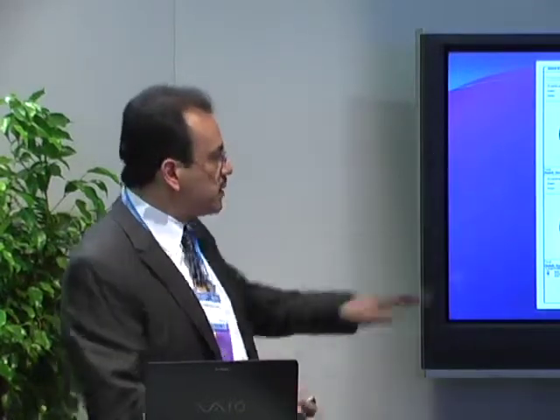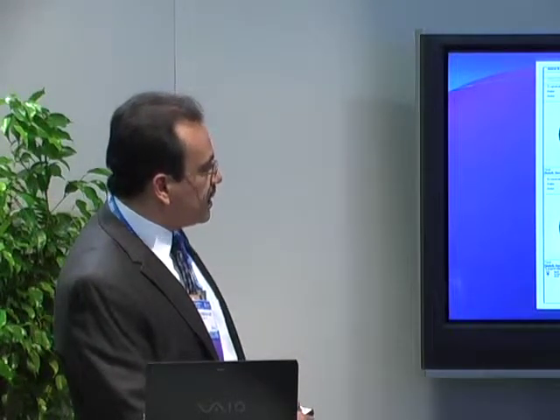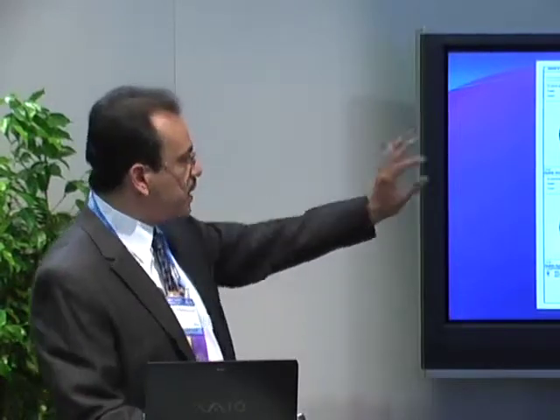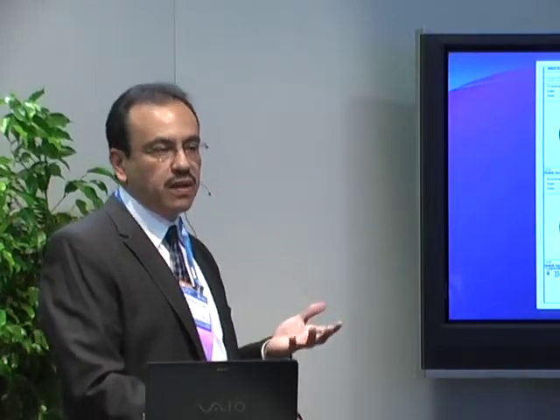So in this subject, because of the problem that she's had in the other eye, specifically, the central scotoma from a hard exudate that improved and cleared, I would monitor that patient and wouldn't want to do anything surgical on her unless she started becoming more symptomatic. But again, I think this is going to be a very sensitive way to confirm any changes that the patient may come back complaining about.